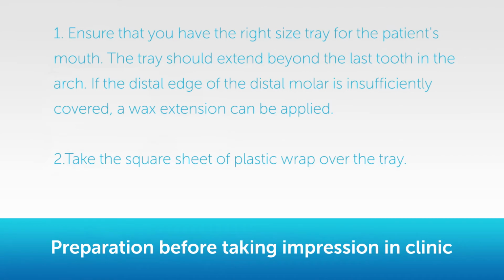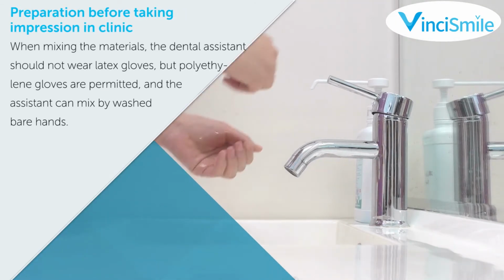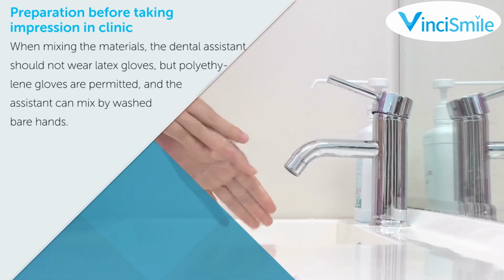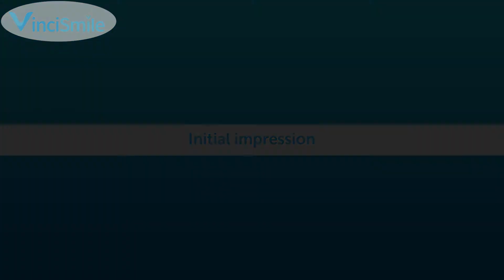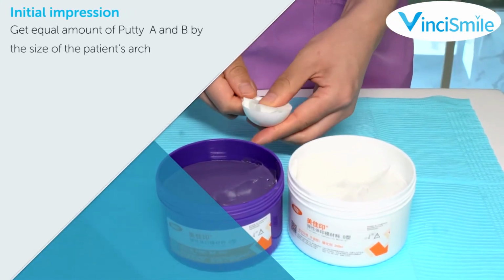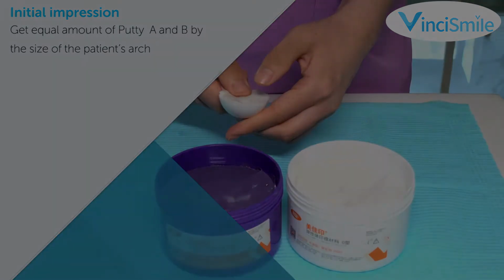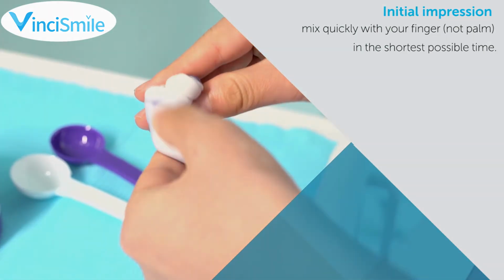2. Take the square sheet of plastic wrap over the tray. 3. When mixing the materials, the dental assistant should not wear latex gloves, but polyethylene gloves are permitted, and the assistant can mix with washed bare hands. Initial impression. 1. Get an equal amount of putty A and B by the size of the patient's arch. Mix quickly with your fingers, not palm, in the shortest possible time.